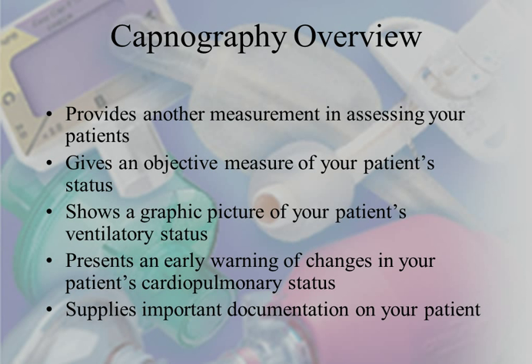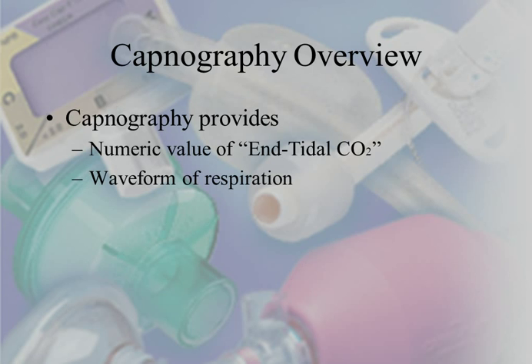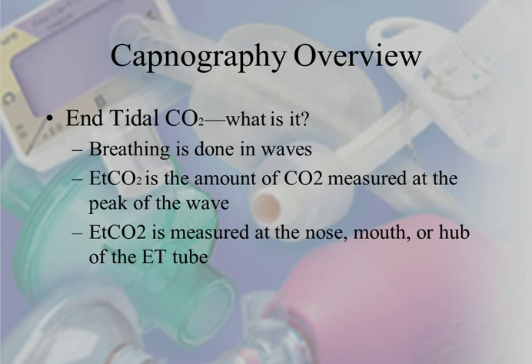Remember that it provides another measurement in assessing our patients. It gives an objective measurement of our patient's status, shows a graphic picture of our patient's ventilatory status, presents an early warning of changes in your patient's cardiopulmonary status, and supplies important documentation for our patients. Remember that it provides a numeric value of the end-tidal CO2 and also the waveform of the respiration.